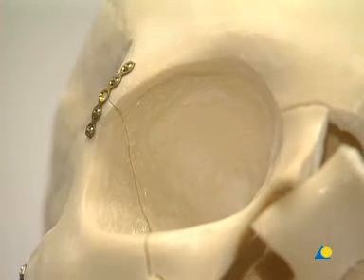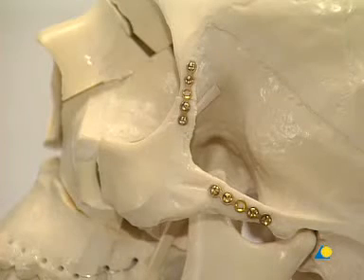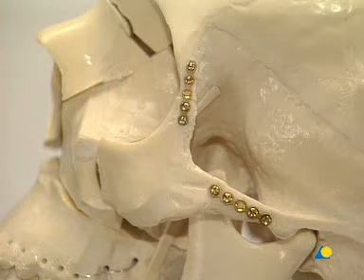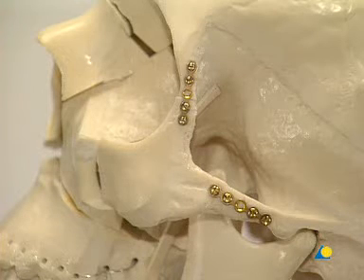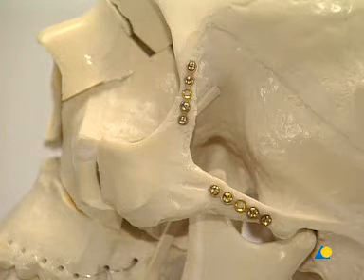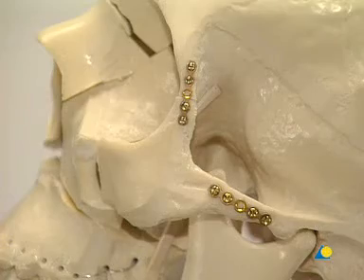The fixation of the zygomatic complex is repeated on the opposite side of the face, with a 1.3 plate placed at the zygomatic frontal fracture and a 1.5 plate on the zygomatic arch.